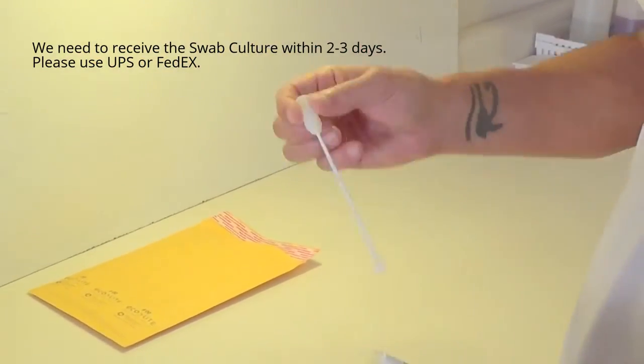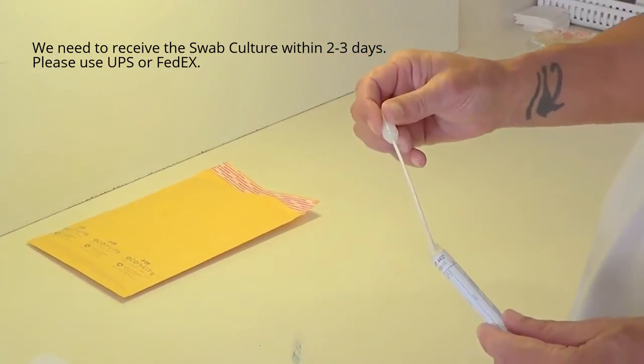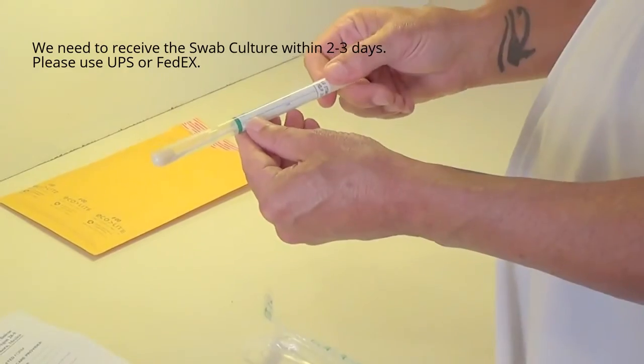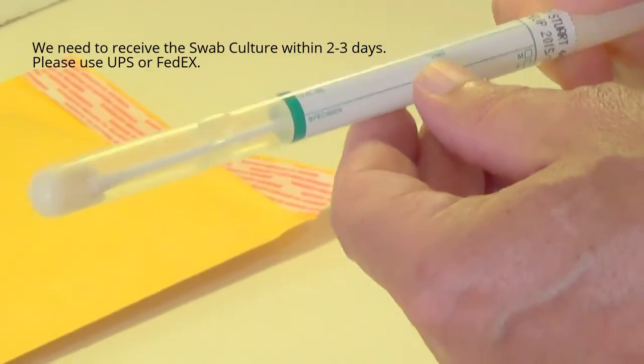That cap is what will go into your swab culture tube once you collect your specimen by rubbing it in the stool. Simply put it back in the tube and push it tightly. Fill in all your personal information on the tube. You do not need to worry about a UR number — that is a number we will assign once we receive it.